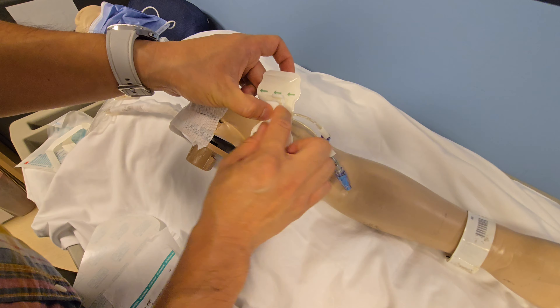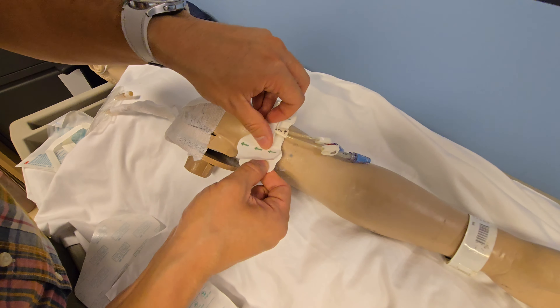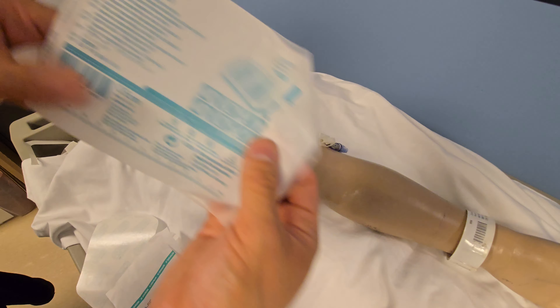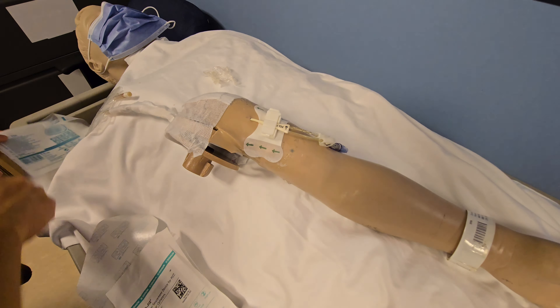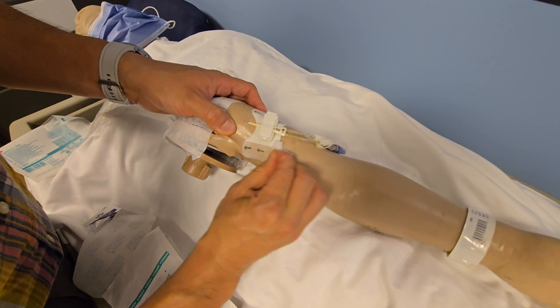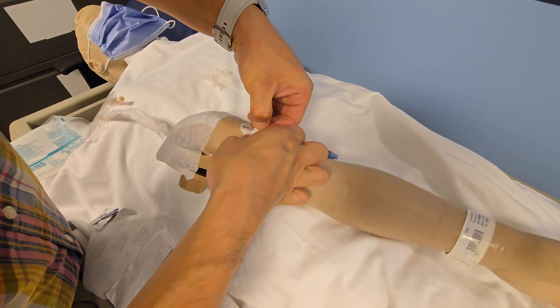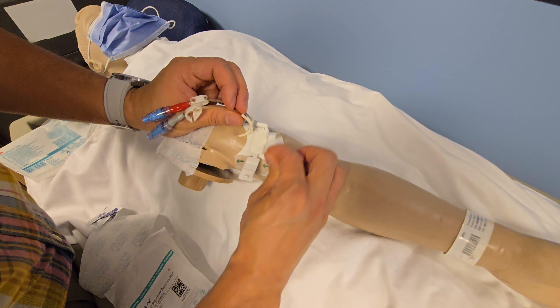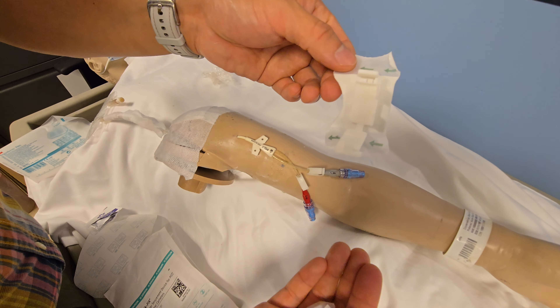When you close it, notice there's a little gap right here — this is where you want to hear a click. Once the line has snapped in, same as the stat lock, peel off the wing from one side, then the other. Cover it with a Tegaderm transparent film and change it per your organization's policy. To remove, use an alcohol swab to moisten the sides, then simply press and click — it opens right back up. There's a little bit of stickiness where the adhesive secures the line, and this part just comes right off.